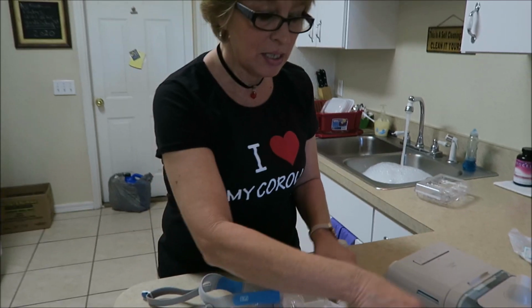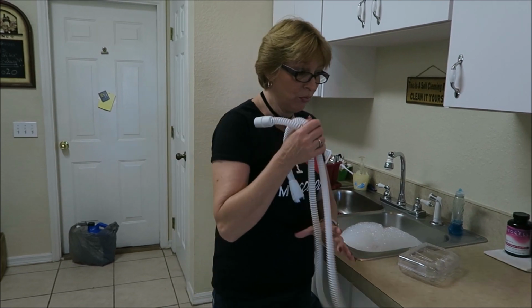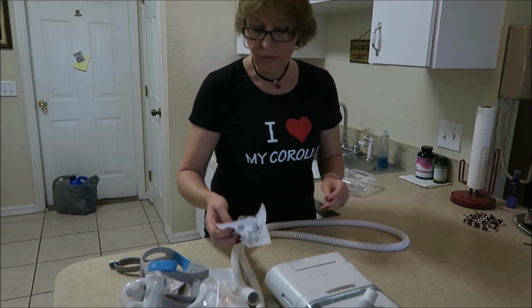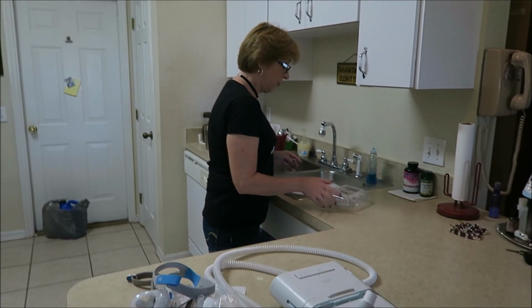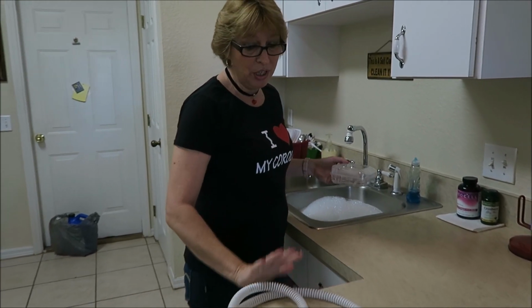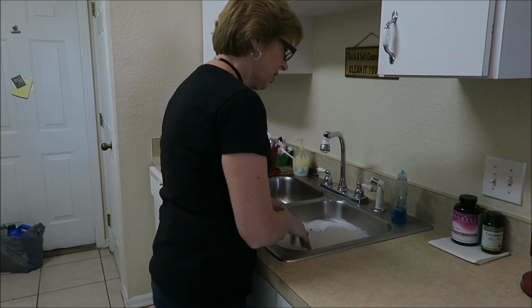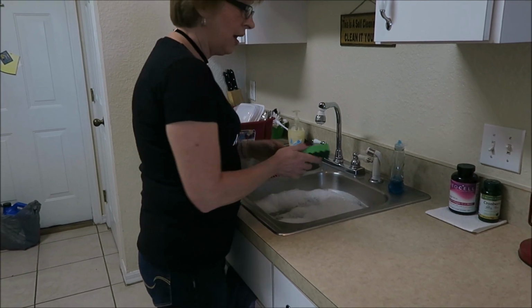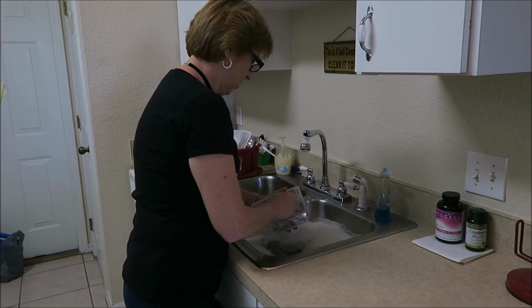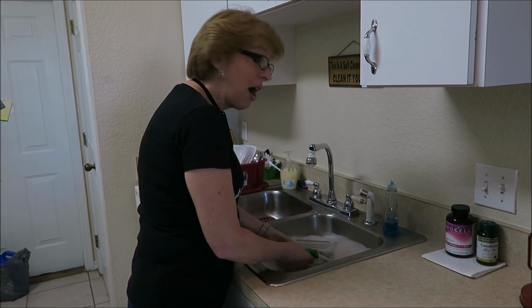This is time consuming, and I get where people just want to hurry up, wash it, and be done with it. But for someone who's worked in nursing for over 20 years and has had to put these on patients, these really are not cleaned properly. You will get a lot of infections. So I have my sterile little sponge that's just for this, and I just wash it out. Again, it's not complicated, but it is time consuming.